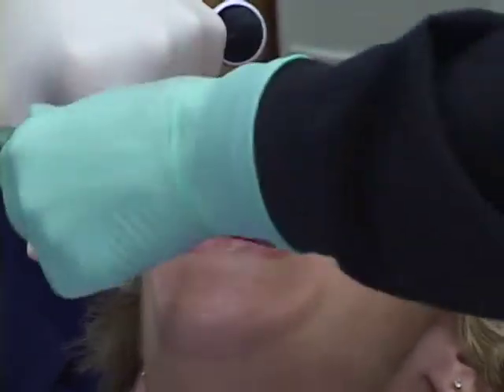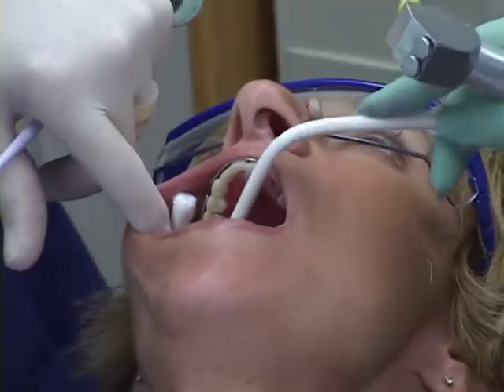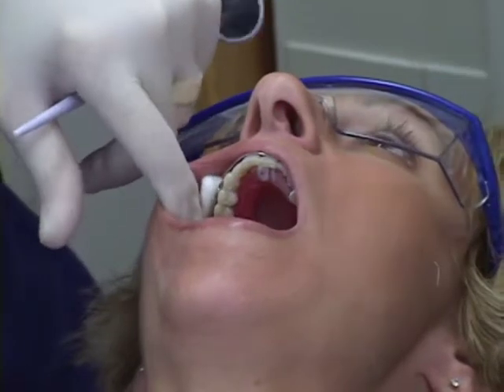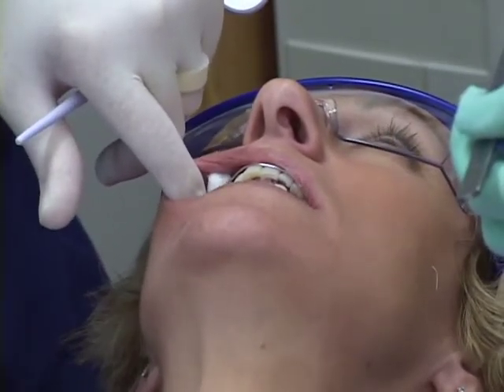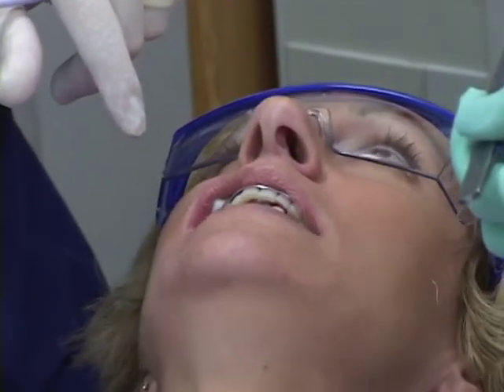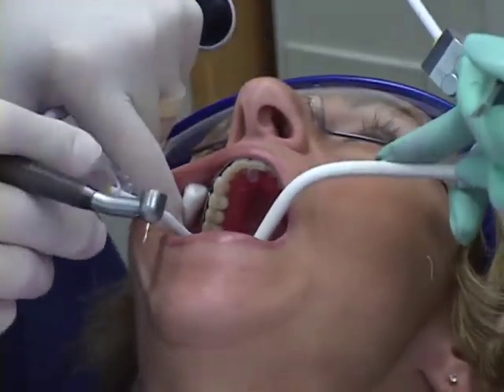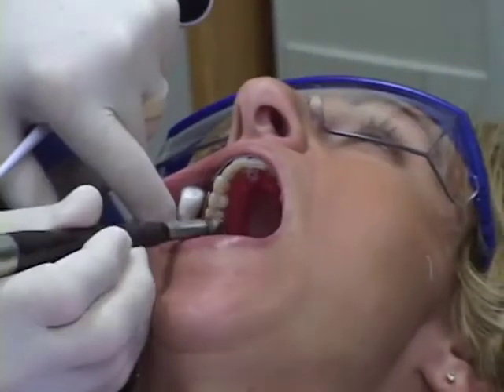Okay. Go ahead and chop, chop, chop, chop. Open. Okay. Debbie, go ahead on your own now. Tap your teeth. What do you feel touching? You feel anything touching at all yet? Not on the left, not yet. Anything on the right at all touching? Yes, in the back. In the back, yeah. Okay, go ahead and mark them. Chop, chop, chop, chop, chop. Open. There we go.